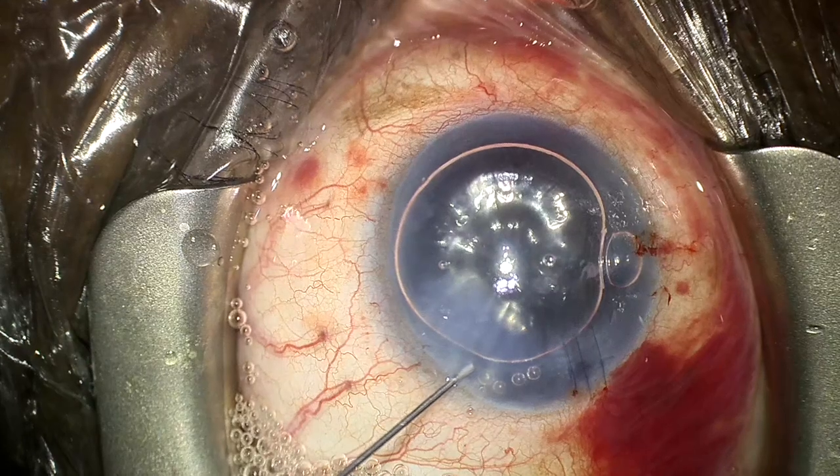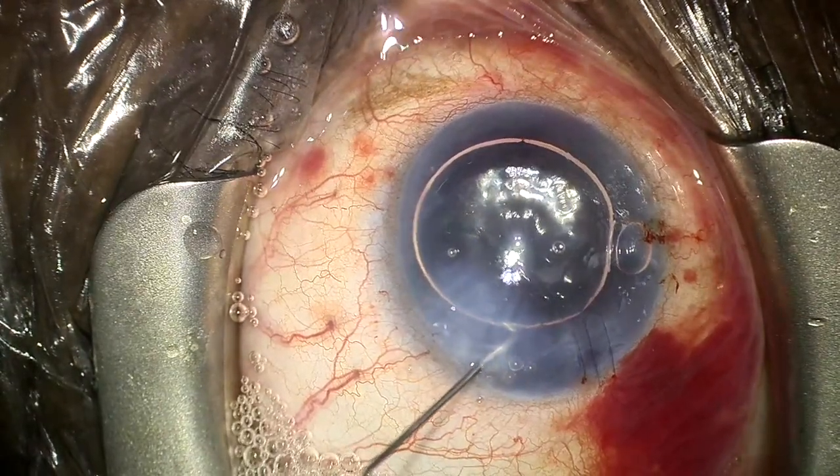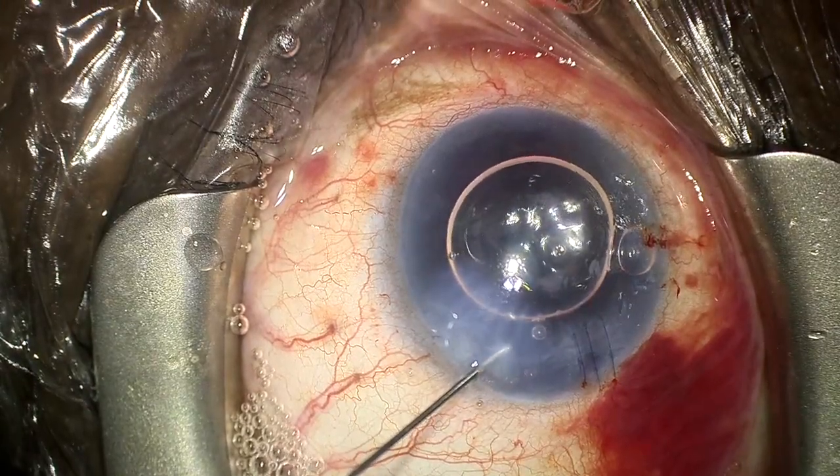After 5 minutes, the air bubble was made smaller so the patient would not go into pupillary block. A small bubble was purposely left in the eye since the area of the detachment was superior, so the superior bubble may help press the Descemet's back into place with the patient sitting upright.